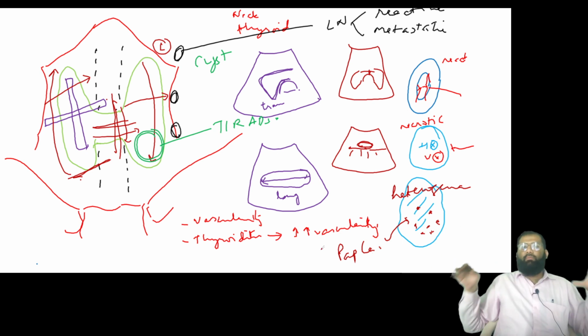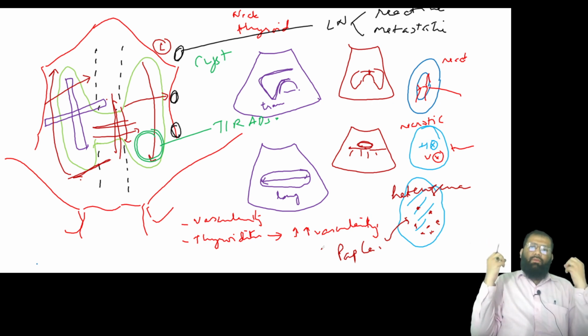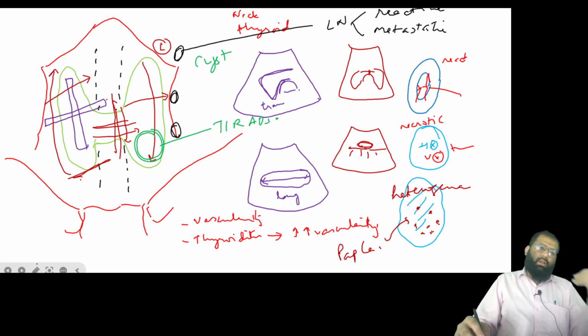So these are all the important features of thyroid ultrasound which are to be kept in mind when you start examining the thyroid. Okay, now with this warm up, what I want all of you to do is look carefully at the demonstration video so that things become very clear to all of you.